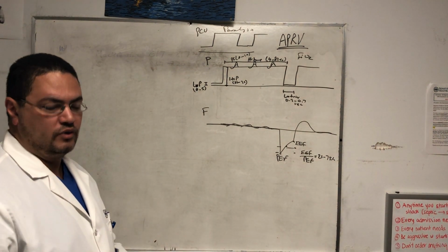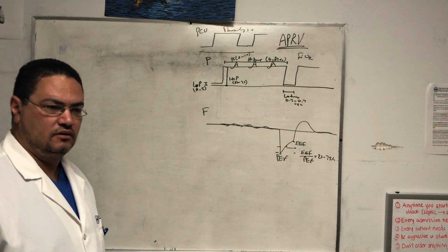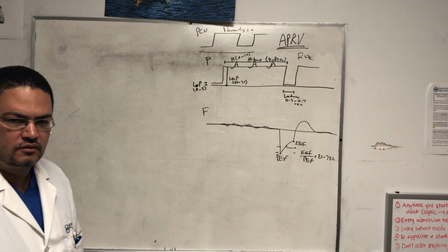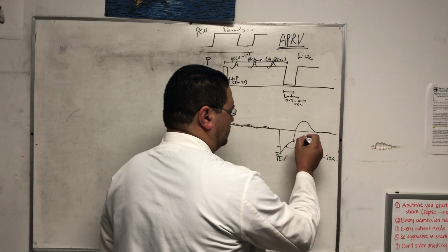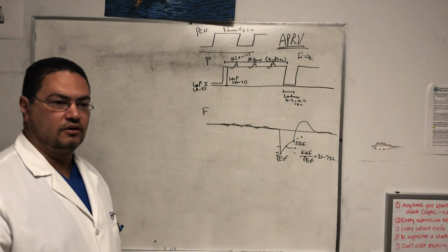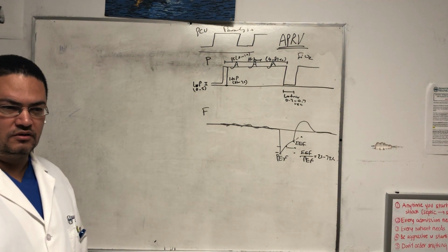How about if we have somebody with a ratio of 10%? What does that mean? Obviously the opposite. It means that we let this go all the way to here, so this became 10% of that, and that means this patient is going to de-recruit his lungs and have hypoxia.